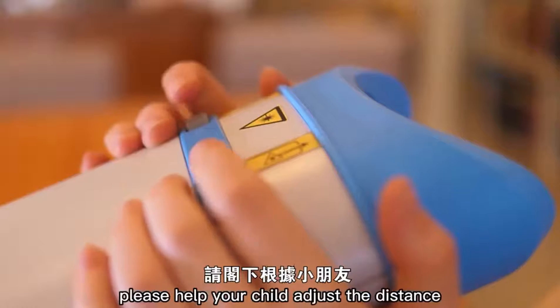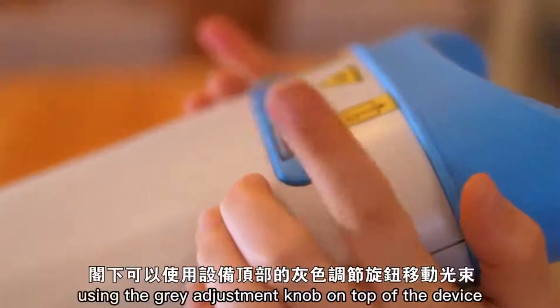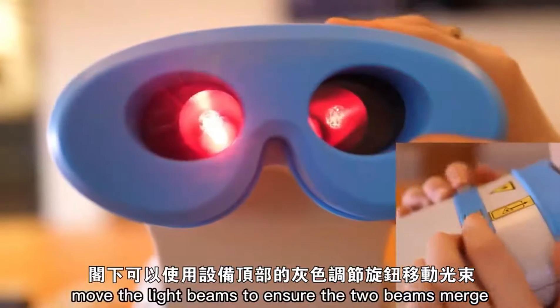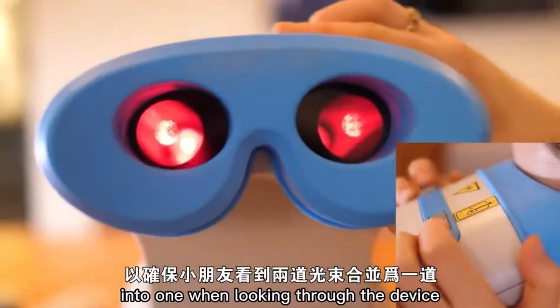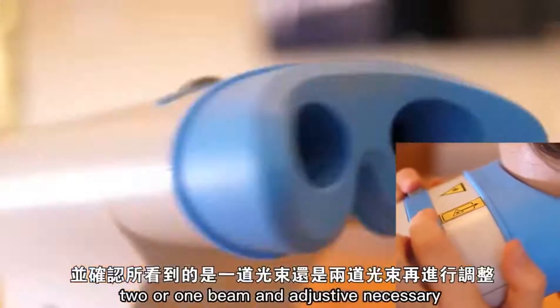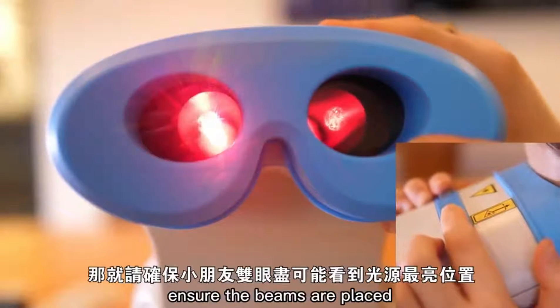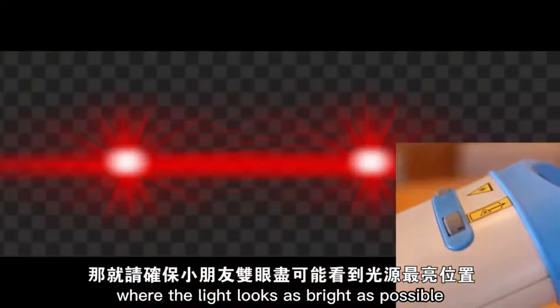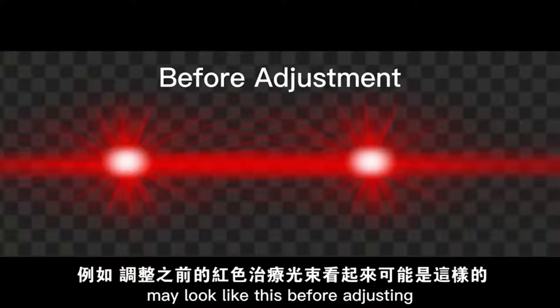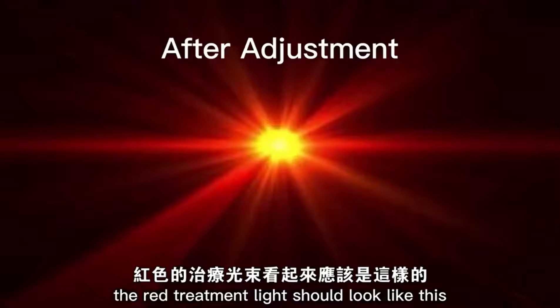For the first use, please help your child adjust the distance of the red light beams between the eyes. Using the grey adjustment knob on top of the device, you can move the light beams to ensure the two beams merge into one when looking through the device. Make sure to ask your child if they are seeing two or one beam and adjust if necessary. If this is not possible, ensure the beams are placed where the light looks as bright as possible. After adjusting the knobs, the red treatment light should look like this.